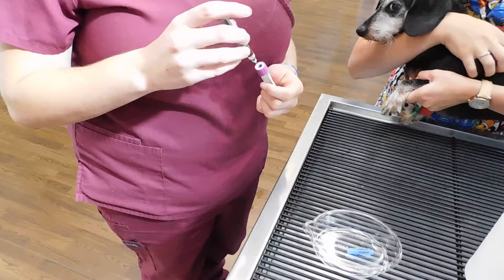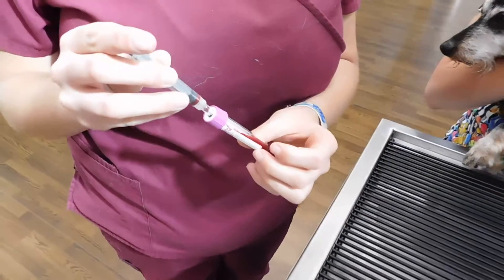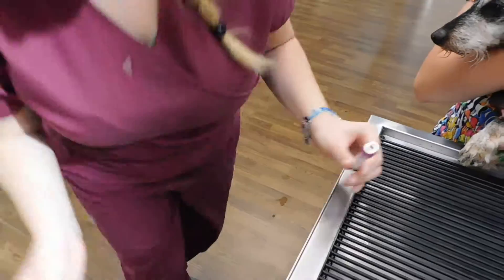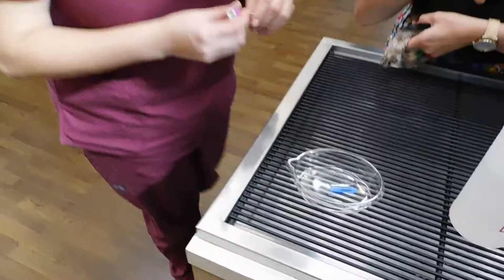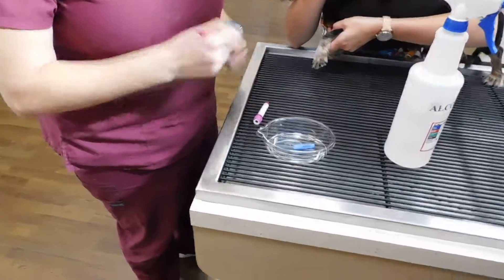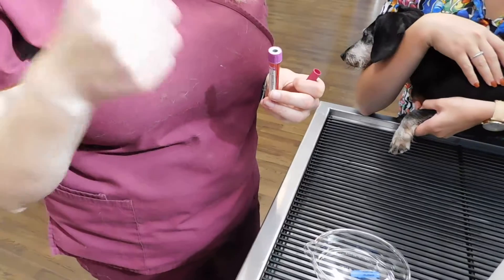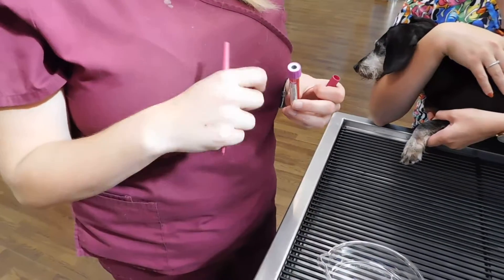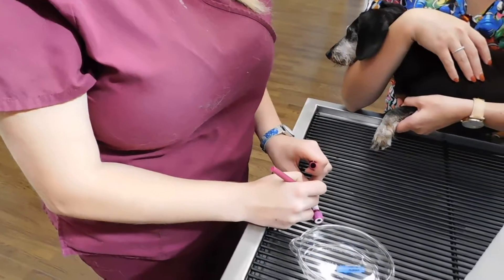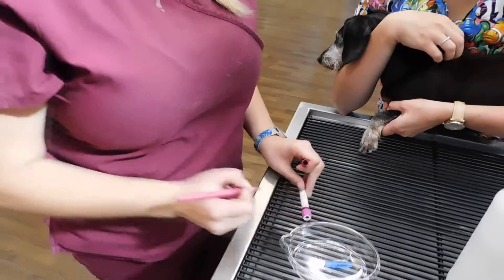I'm going to put my sample in my tube — it's not a vacutainer, so I do have to push my sample in. We're going to want to write the patient's name and date. If it was a vacutainer, I wouldn't push the plunger — I'd let it fill up the amount that it needs, and then remove the needle. So name and date of the patient, and that is it.